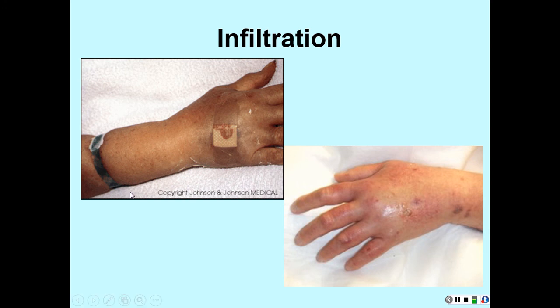Because if it can't go there, then it starts to leak out into the tissues, okay? Take your tourniquet off. Okay, take your tourniquet off. Teach your patient how to report signs of discomfort. Like I said the other day, IV therapy should not be painful.